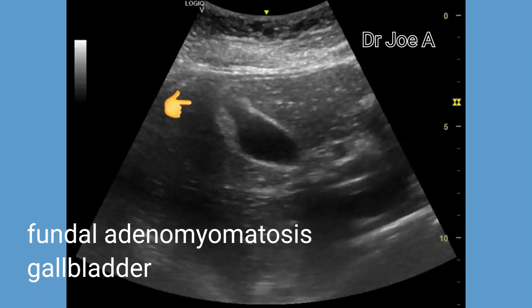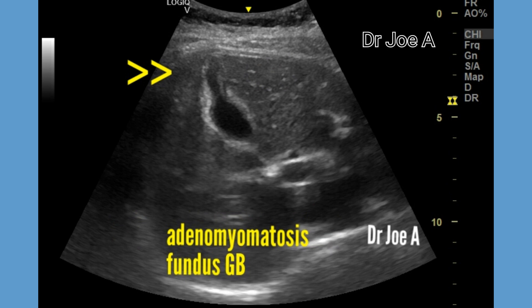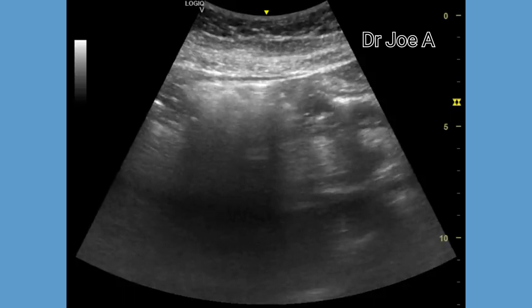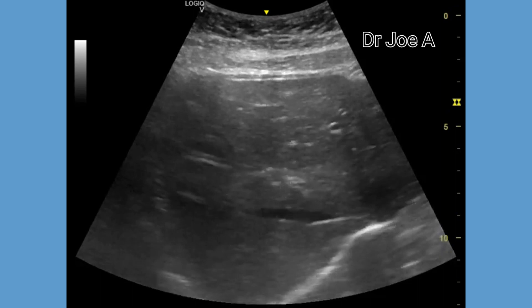This is a patient of fundal adenomyomatosis of the gallbladder. The fundus of the gallbladder shows wall thickening with narrowing of the lumen. In this condition, the inner layer of the gallbladder — the mucosa and the muscular layer — undergo marked thickening with narrowing of the lumen of the fundus. The rest of the gallbladder appears normal.